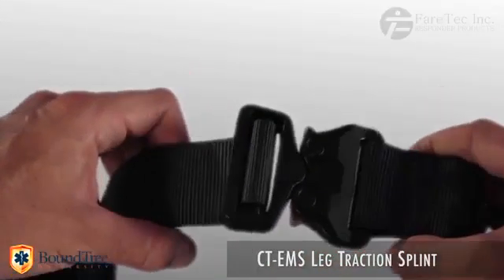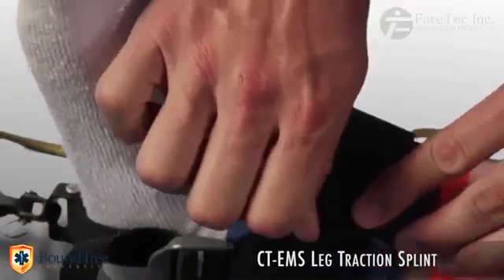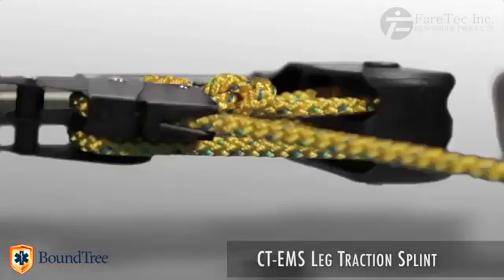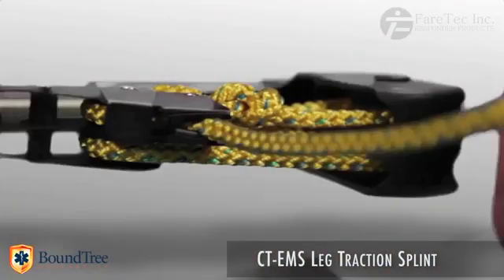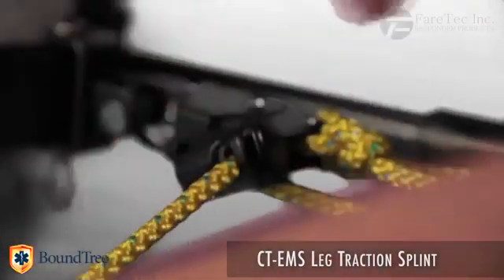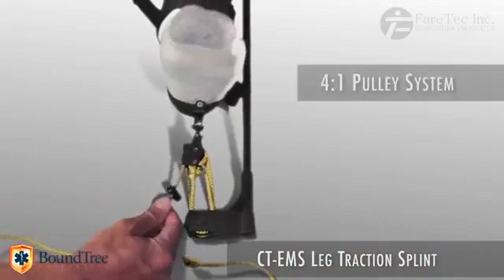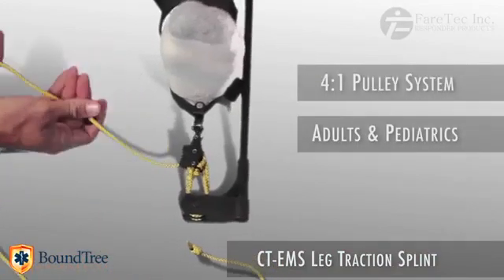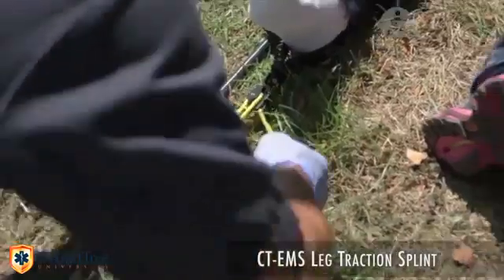The splint also features heavy-duty elastic strapping. The CT-EMS utilizes a four-to-one integrated pulley system that can be locked off at precise increments. This traction method allows for perfect adjustment on large patients that require many pounds of traction, and on pediatrics that require a delicate, precise amount of pull.